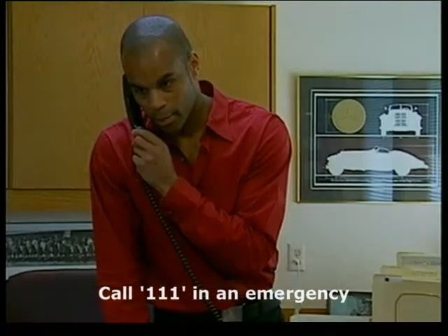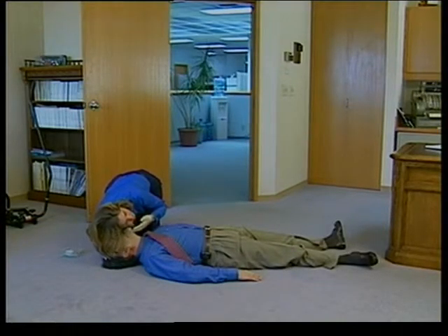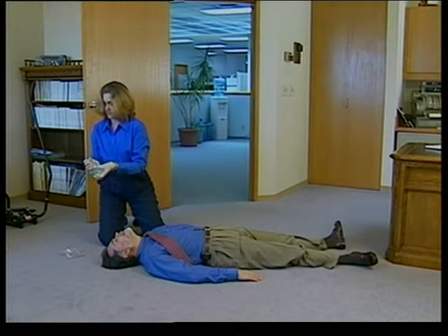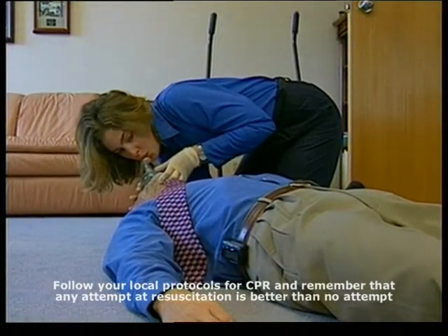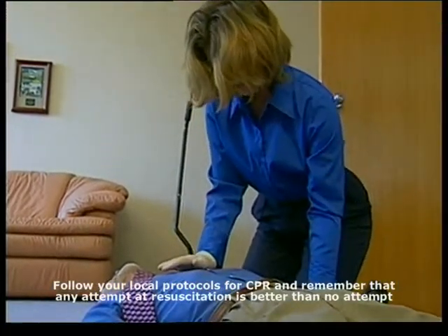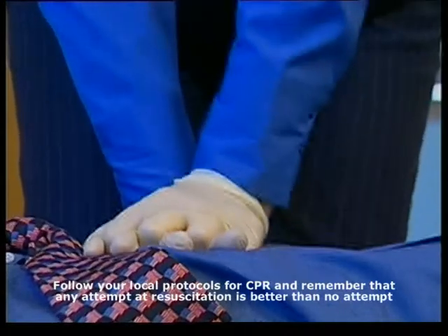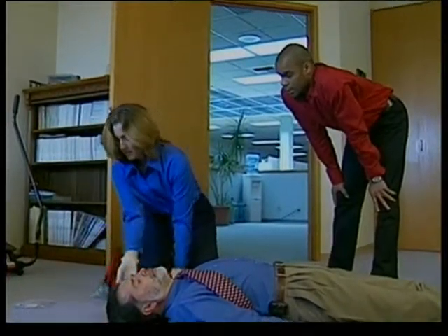Katie, this is Quentin. I'm in Armando's office. He's collapsed and he's not responding. I need you to call 911. Okay, thank you. He's not breathing. Get the defibrillator. It's on the wall by my office. Okay. One, 2, 3, 4, 5, 6, 7, 8, 9, 10, 11, 12, 13, 14, 15. This is a defibrillator. I'm going to go down, meet the ambulance, bring him up. Okay, thanks.